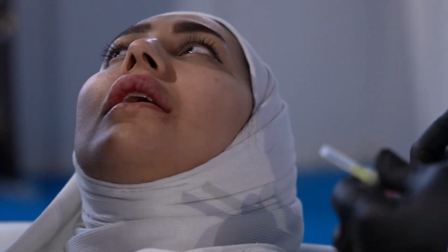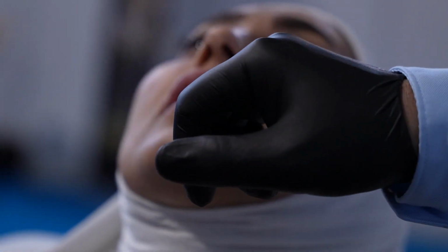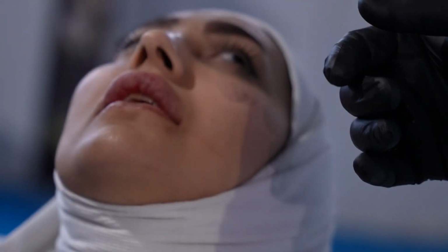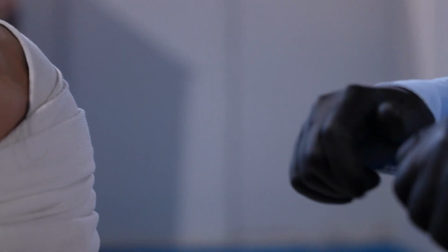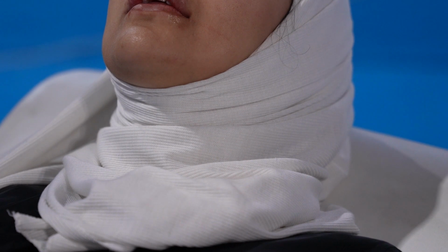Now the upper lip looks larger because she has, actually, we should have the photograph from before. She had a lot of fissures like a hare lip, cleft lip. So from the first, it was not a good candidate for demonstration. We should have a normal lip, so that we put too much volume at the end just for correction. Any injection is puncturing and there will be bleeding and more volumization of the area. But this increase in size will subside within 24 hours or less than 2 days.